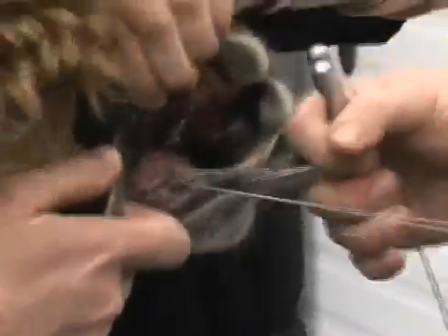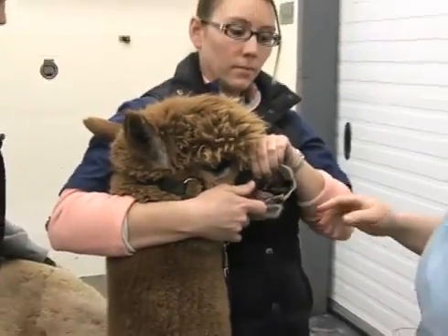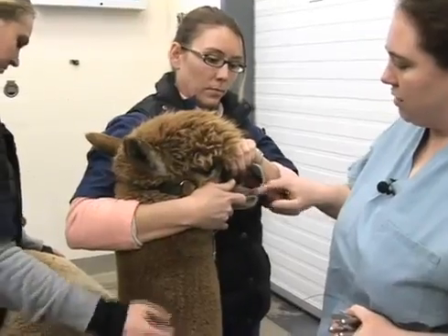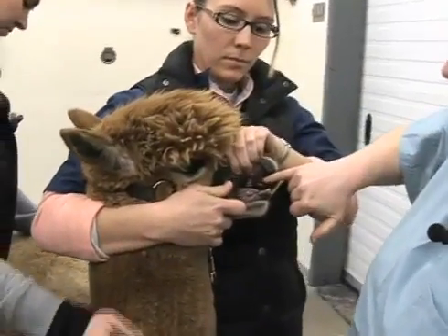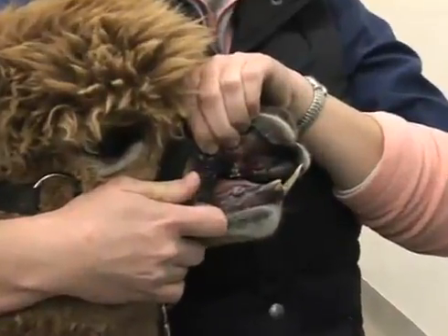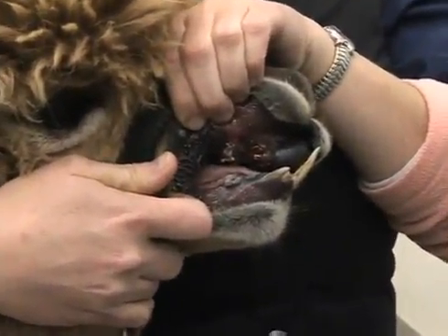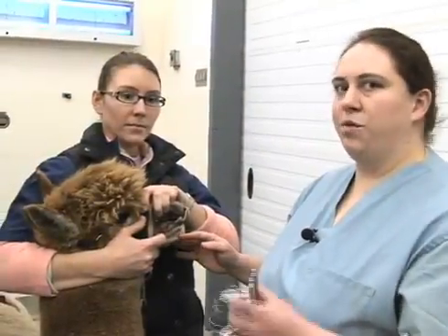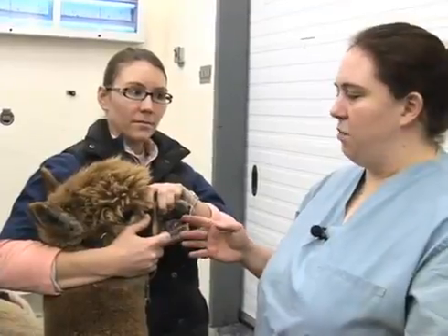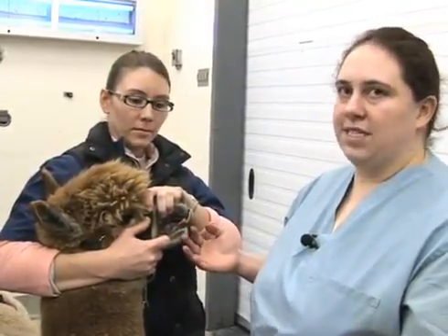A lot of times the animal will resist and pull back, and that's okay — it actually makes your job a little bit easier. You can see that these are all done. There is just a little bit of bleeding at the gum line, which is not uncommon, and this small amount will resolve on its own over the next couple of minutes. After you've removed all the fighting teeth on this side, use the same procedure for the opposite side. You may have one, two, or potentially all three on each side, for a total of up to six teeth that need to be removed.